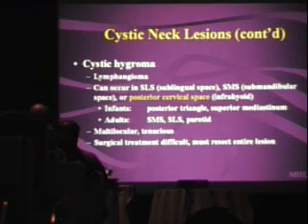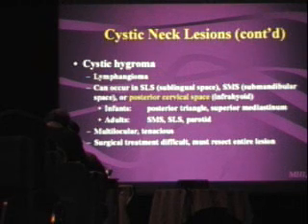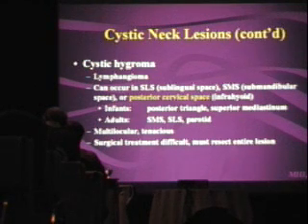If you have a patient who may have one of these, you can ask them to do a Valsalva. You may actually see them blow up. And a good clue is just clinically, as the patient's getting in the scanner, you can look at the skin. Is it tinged blue? Is it tinged purple? These often will have venous components which can look really T2 bright. And because they're slow flow, there might not be a flow void. You could get faked out.